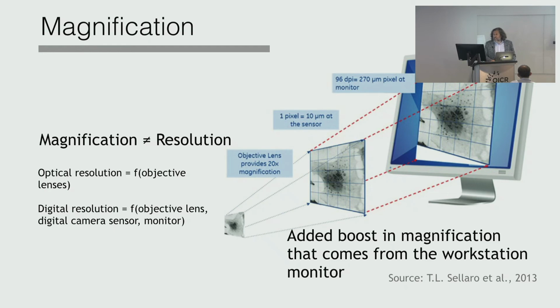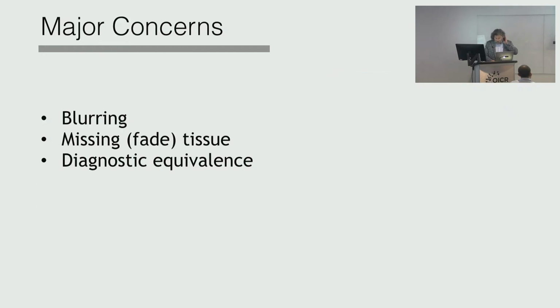So these are things that people are elaborating on and reflecting on to make a decision to go digital or not go digital. But there are three major concerns. Not money-wise. Again, administrators of the hospital will lecture us that this will cost money, and we don't have that kind of money to completely change the IT infrastructure. An average lab may do 700 patients a day, each one of them 2-3 glass slides, times 365 days. So that's terabytes and terabytes of data, and you need infrastructure to do that. We are not concerned with that.